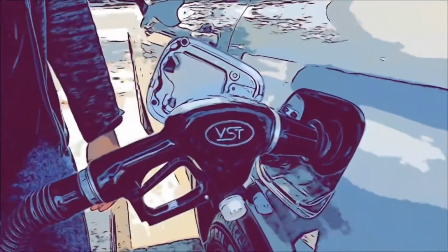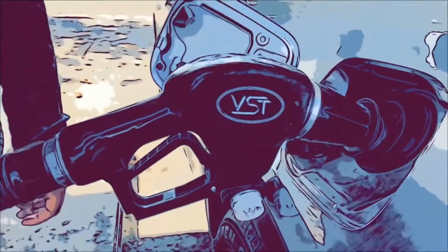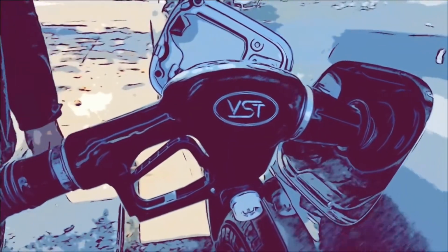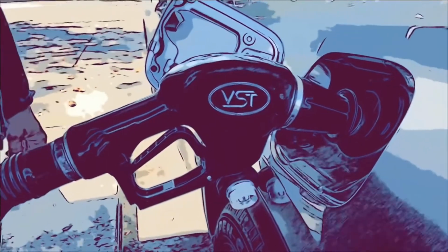To help you understand the concept of AEC, we decided to use pumping gas as our example. Gas pumps have a certain amount of fuel that can go into the tank, and it has an automatic shutoff, like how the AEC functions when an X-ray is taken.